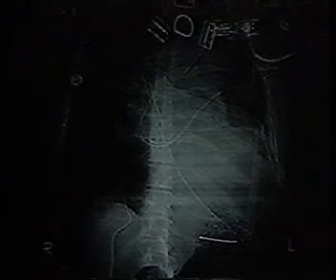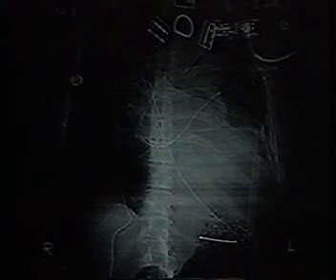Here's another example of a patient who had a persistent, very large fluid collection at the left lung base. It's very difficult to see on this image, but there's a large surgical chest tube that's placed all the way up in the upper part of the thorax here. And the patient was having persistent fever, and so we brought the patient to computed tomography and tried to drain this collection. Here you can see a catheter which is in this very complex-looking fluid collection at the left lung base. Here you see a fluoroscopic image of the same catheter.